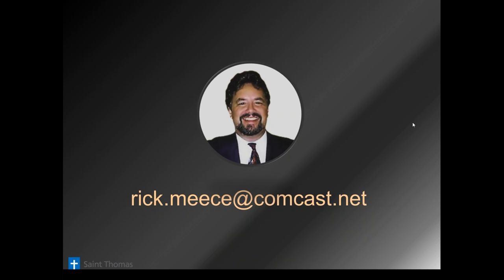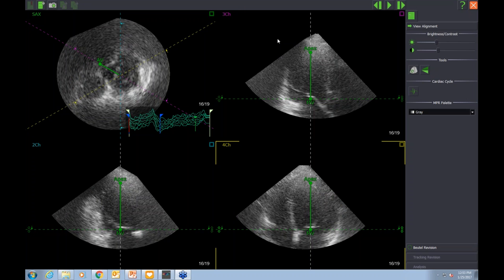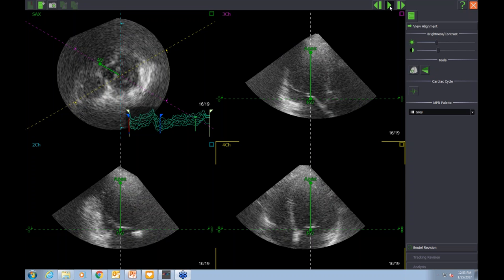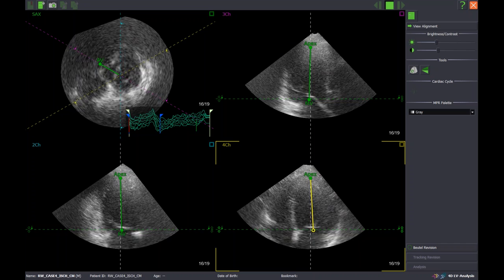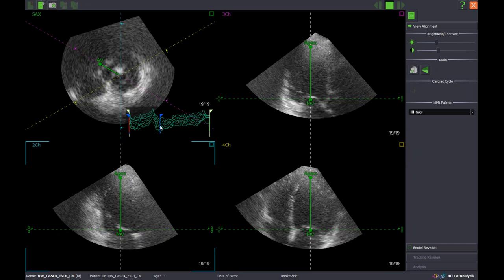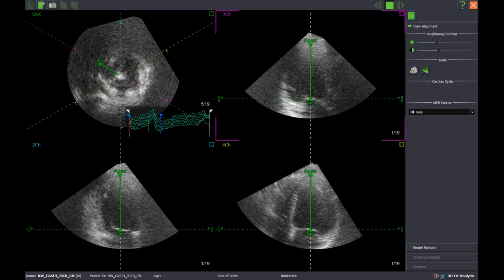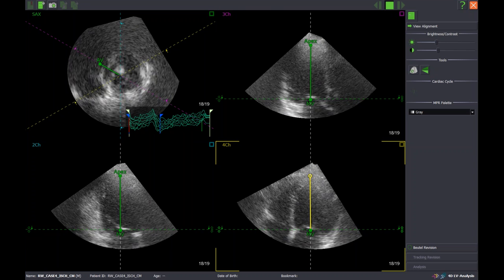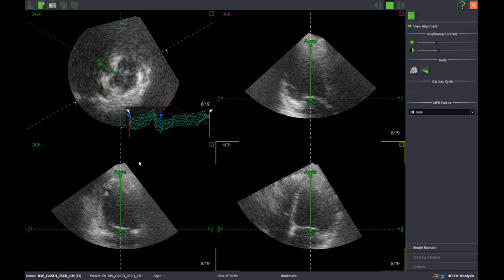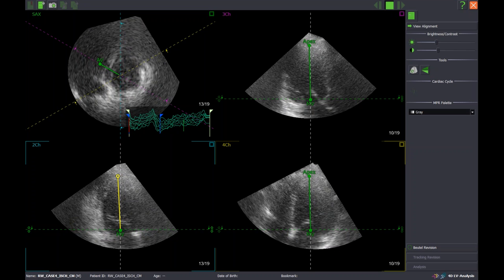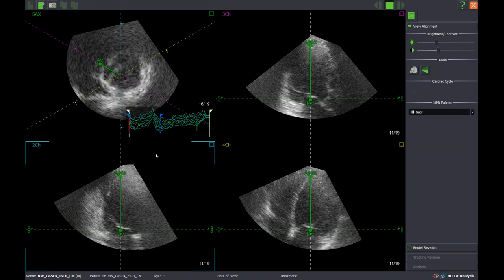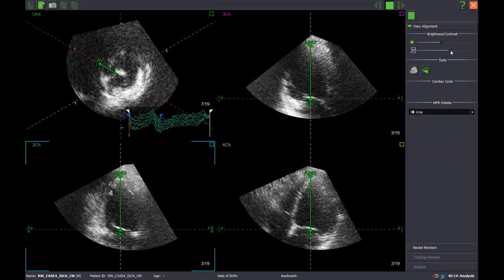Now I have a data set loaded here in LVA — looks like several beats, but this is a bad data set. Anybody who's been in my courses knows I don't fool around with perfect young patients with great data sets. When they come to my course, we're going to be looking at what they see every day at work — a data set not too far from this. It's a little grainy, you can kind of sort of see what's going on, but it's not that clear. That's what we live with. So I'll try to adjust the brightness and contrast to help see the edges of the images better, sometimes increasing contrast and brightness a little and finding a happy medium.